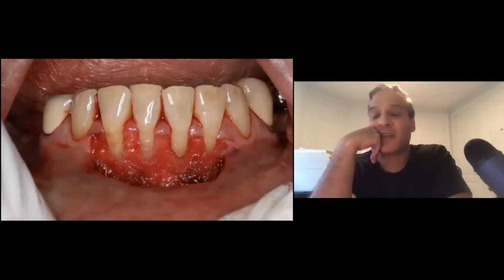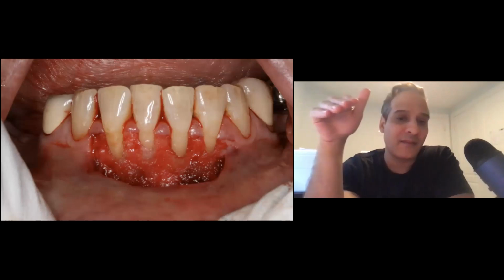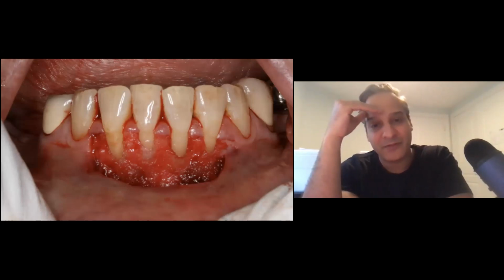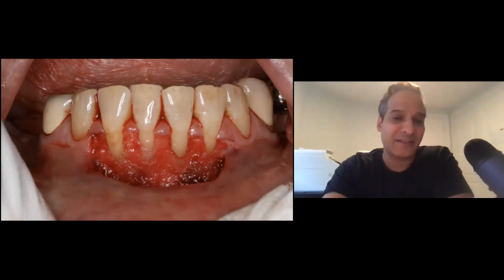So this is slowly, we just go in and we peel everything out. Now, sometimes I just cut the excess tissue out. You don't always need it. Sometimes I just apically position and suture. In this case, it looks like I cut it out because my goal here was just to gain a band of keratinized tissue. I didn't need any of those papillas because they'll just be harder to stitch closed.